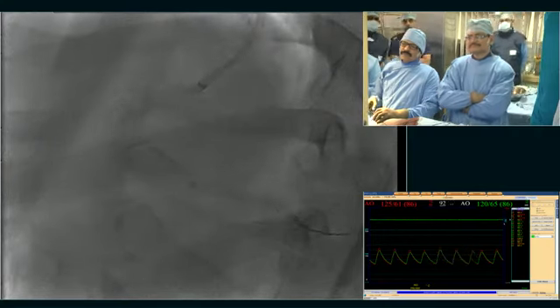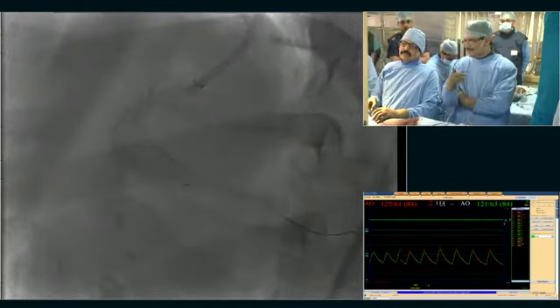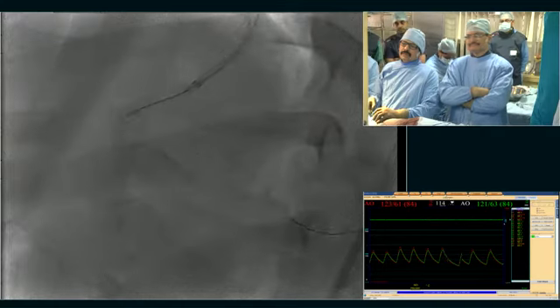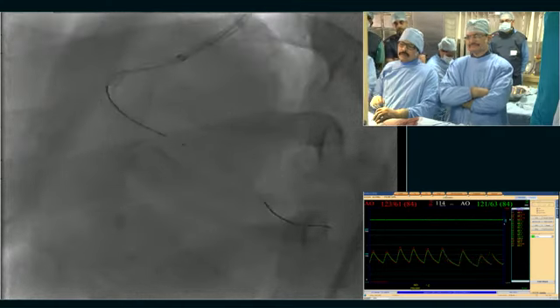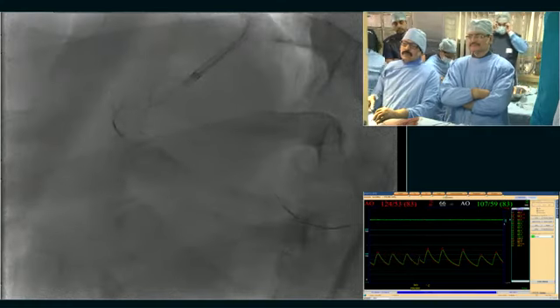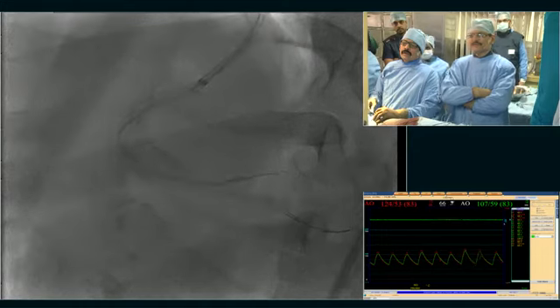It's hydrophilic. I'm not sure whether a polymeric coat would be useful, because I think the NC balloon will dilate, and the coat will be damaged with torqueability. So in this case, we need a trackable wire.